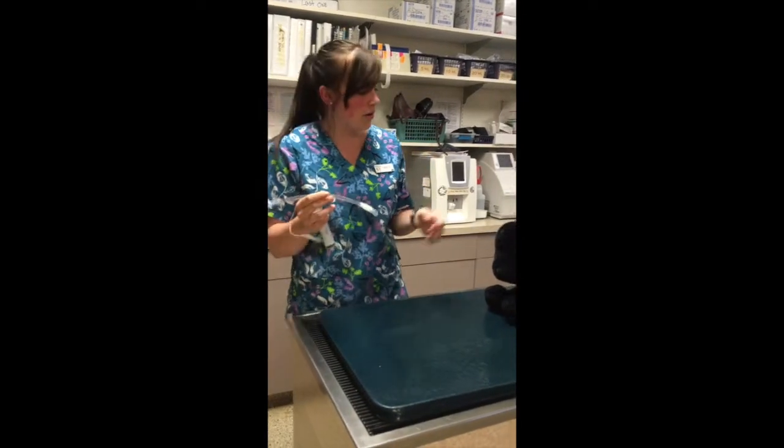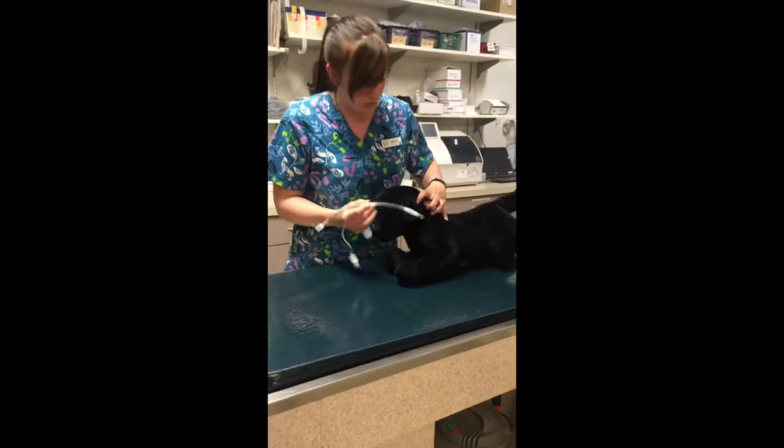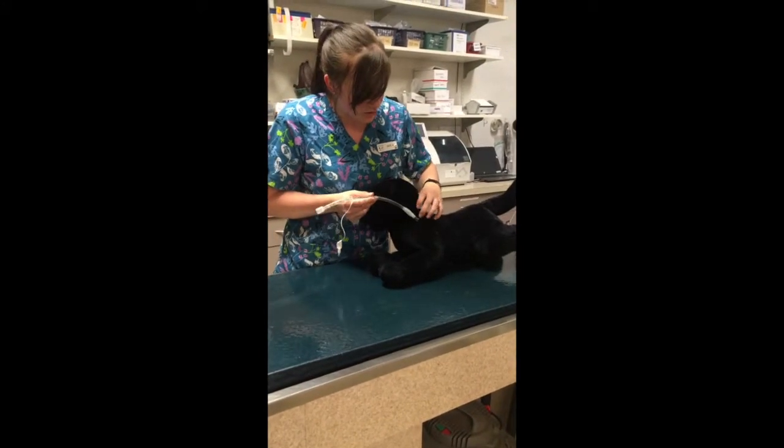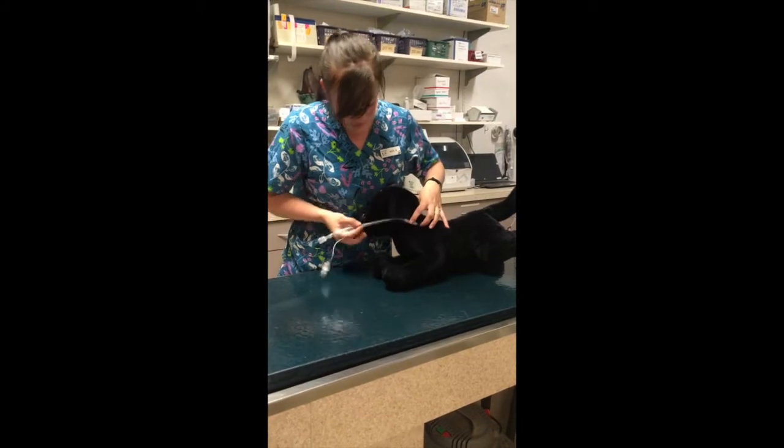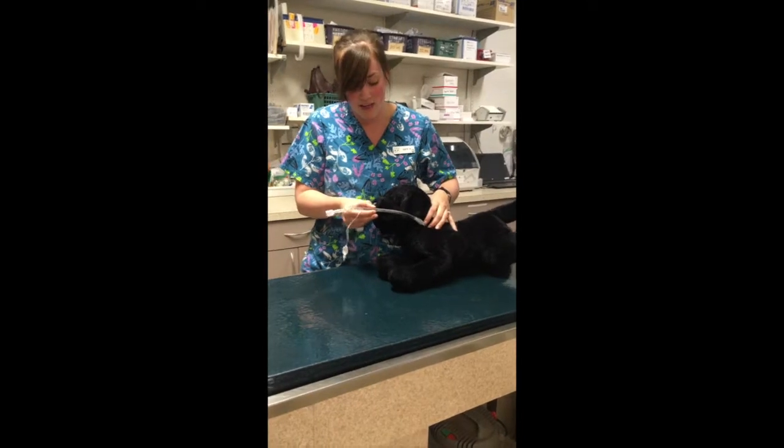So then when you are going to insert your endotracheal tube, you want to measure how long you're going to insert it. So what you want to do is take the tube and measure from the tip of the scapula to the edge of the nose. And that's how far you'll insert your tube, and that's where you're going to tie it and secure it to your patient.